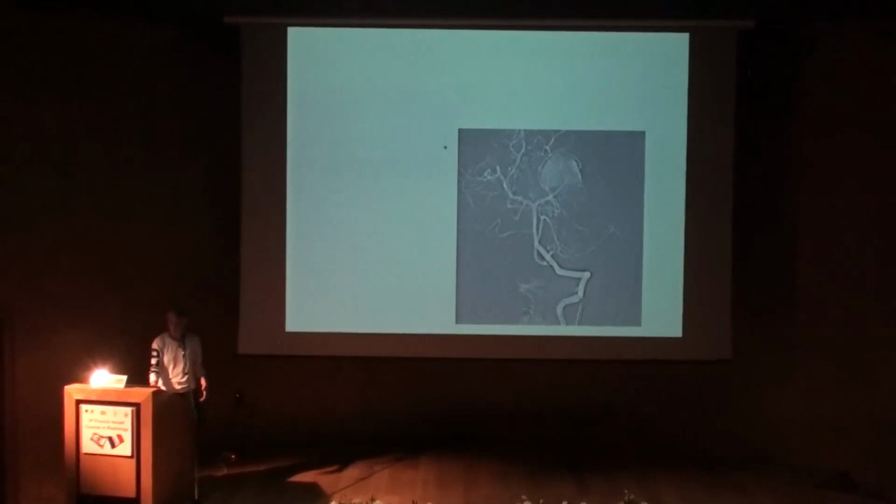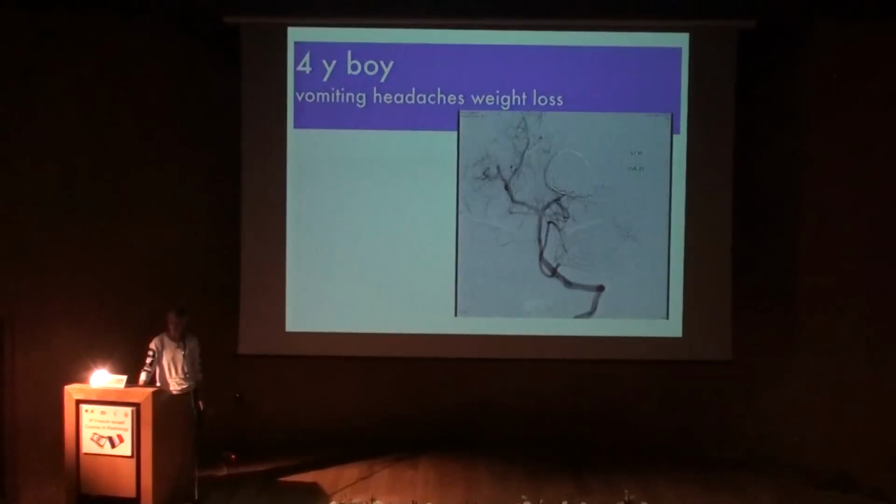This is just during the procedure, we were doing a balloon test occlusion. It doesn't matter so much, but you can see how the wire just falls into the aneurysm. There's no neck, it just opens into the thing. The whole vessel is dissected and sick. And this is why after you treat this patient with coil, you lose the PCA, because the PCA is diseased. It can't hold this thing by itself.